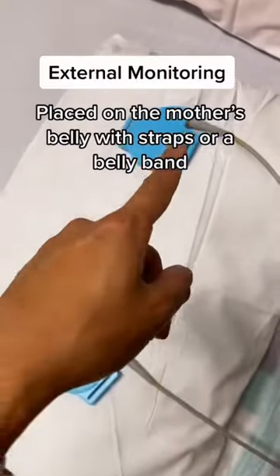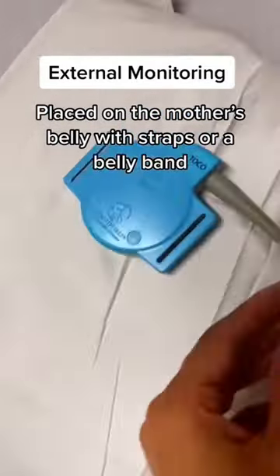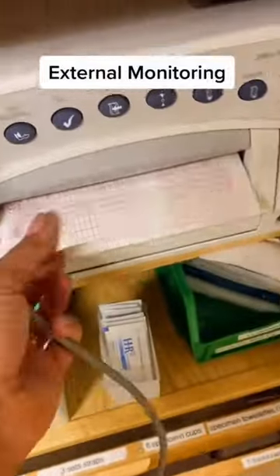This is the typical external monitoring device. You have the ultrasound — you put gel on it and place it on the mother's belly to find the heart rate. This is the TOCO, which monitors contractions, and it is attached to this machine which prints out paper.